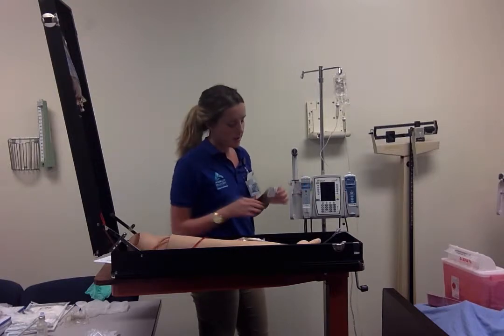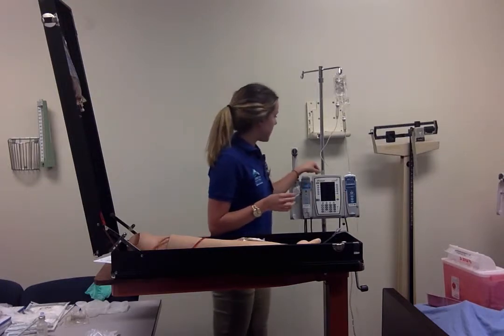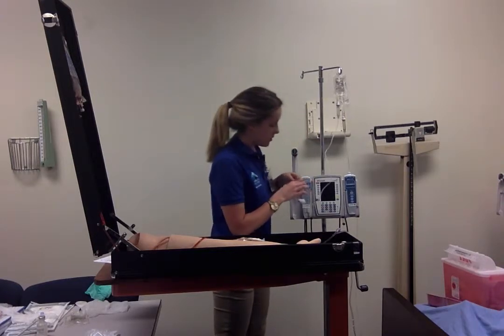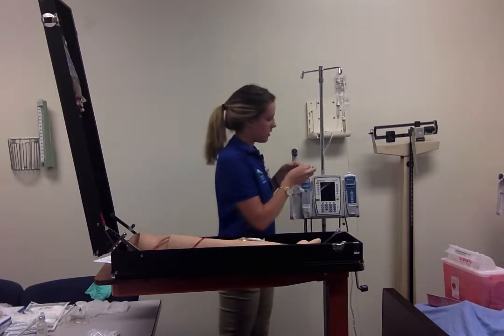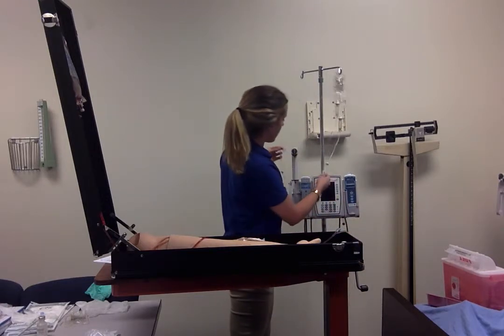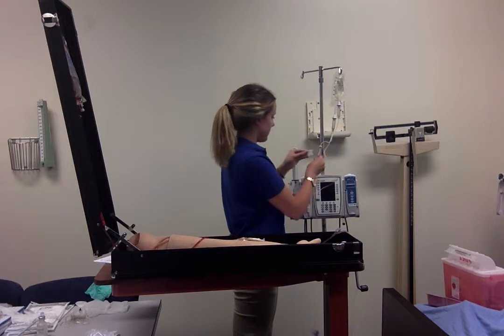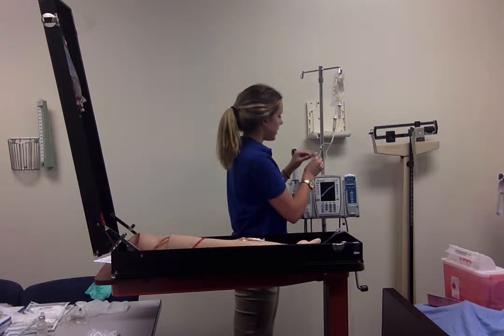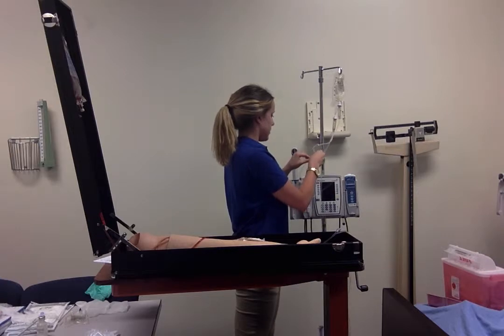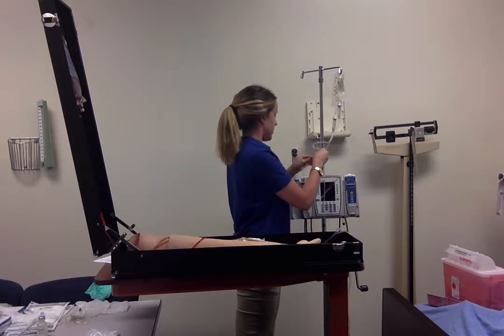No pain? Okay, good. So now I'm going to connect the piggyback to the primary. I'm going to make sure this is all clean and this port is all clean.